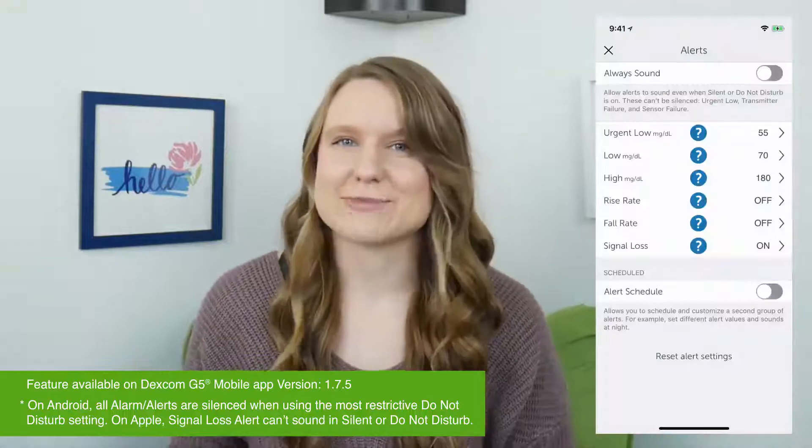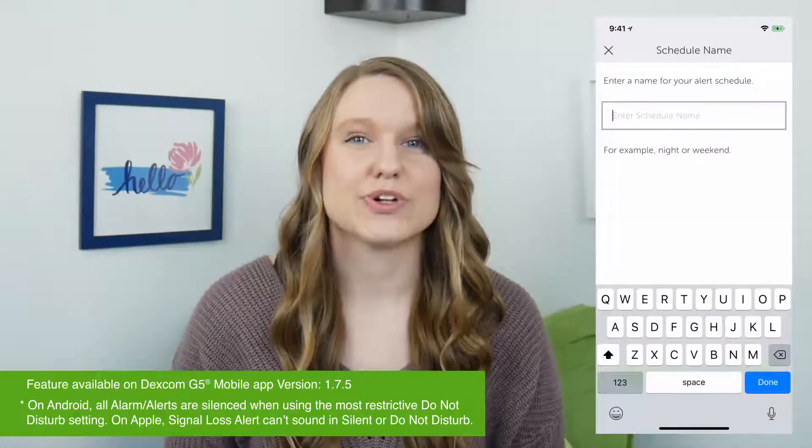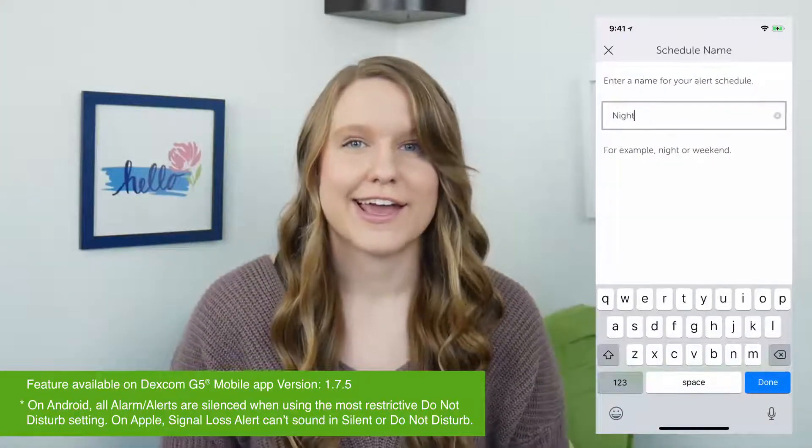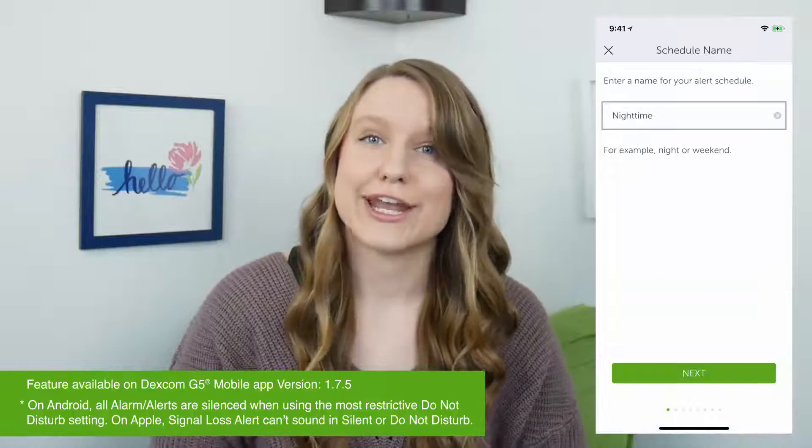For example, I can set up nighttime alerts. To do this, I went to my Alerts menu, I turned Alert Schedule on, and I named my alert schedule "nighttime."